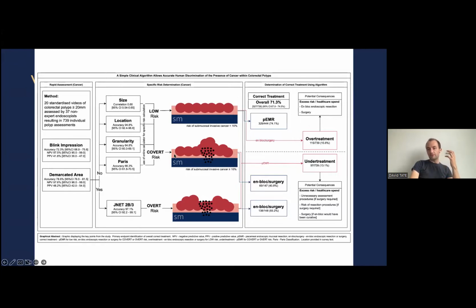Why is that? Because if you have a nodular polyp like this one here, the cancer can be buried beneath the nodule and can be invading into the submucosa from underneath the nodule. But as the endoscopist looking from above, you may well not see it. Whereas in the other example here, where the polyp is depressed and clearly has a demarcated area, you can see the cancer in black on the surface.